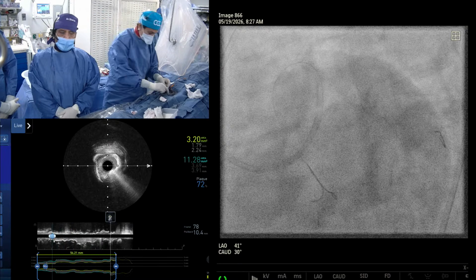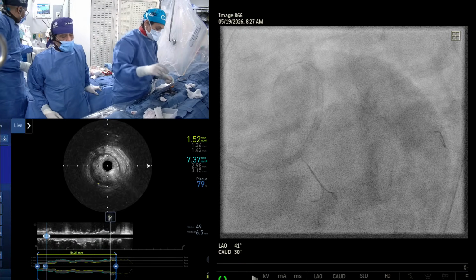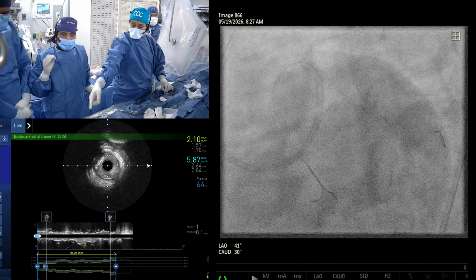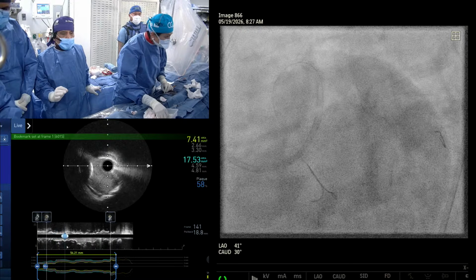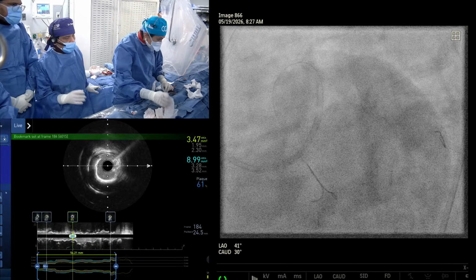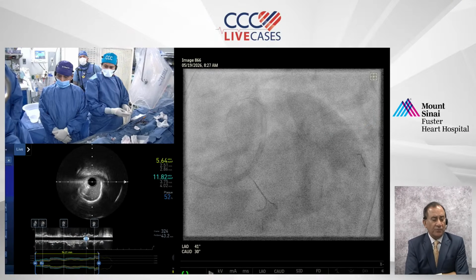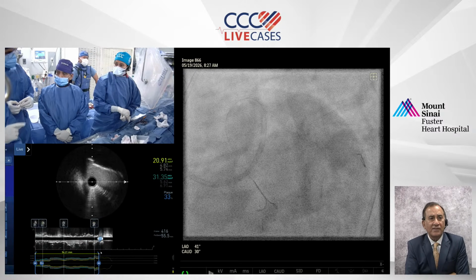So coming back to Samir, your question. You probably heard that now I have made the point. Nowadays, in this day and age, with the advent of safety of the IVL, your second burr is IVL. Very simple. Either you use a 1.25 burr, whatever you use, if you want to get a second burr, it is your IVL. Excellent, which was also a question asked by a few people about proceeding with the 2.0 burr. Instead, the second burr is IVL.